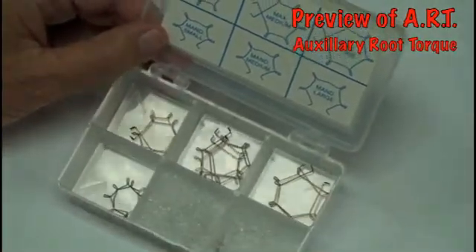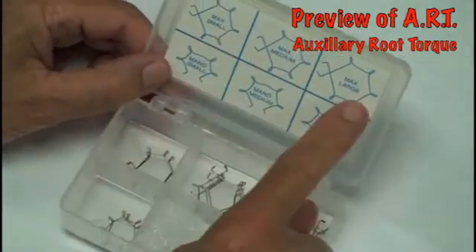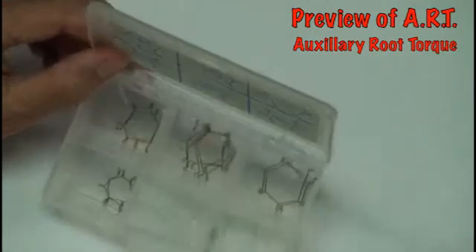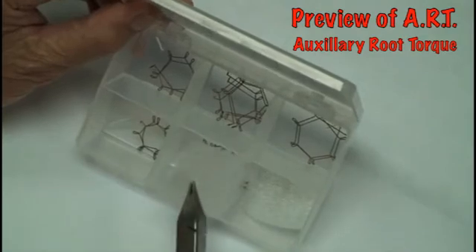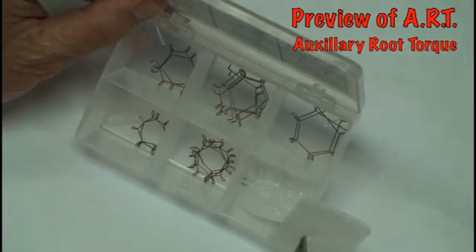The kit comes with a variety of root torquing springs. As you can see from the lid, these are the uppers and these are the lowers. When you receive the kit, they're organized with a small piece of plastic so that they don't bounce all over and cause confusion.